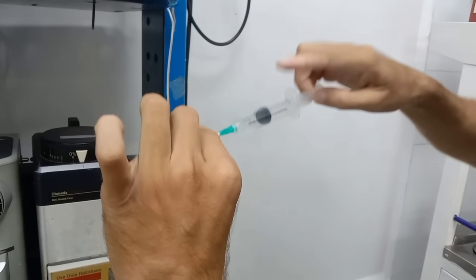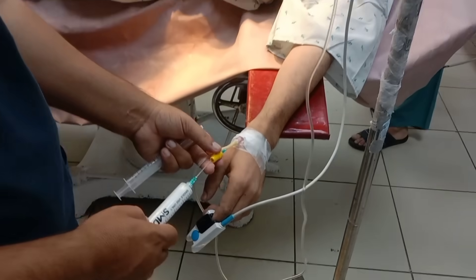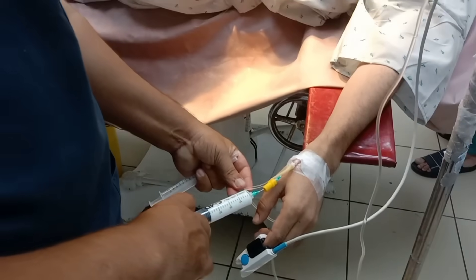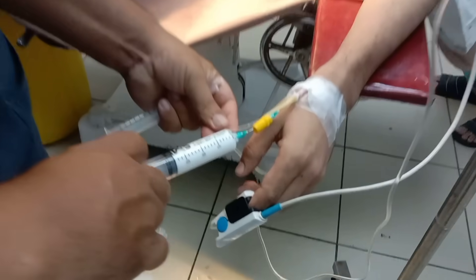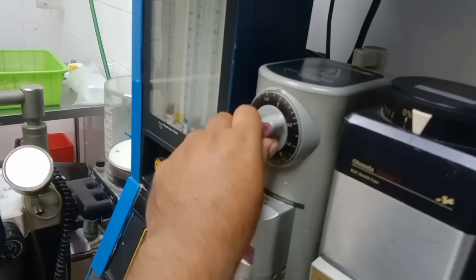Preparation of anesthetic drugs. Once the IV line was secured, I prepared the anesthesia medications. I drew up propofol for induction and a muscle relaxant to facilitate intubation. These medications were kept ready in syringes.